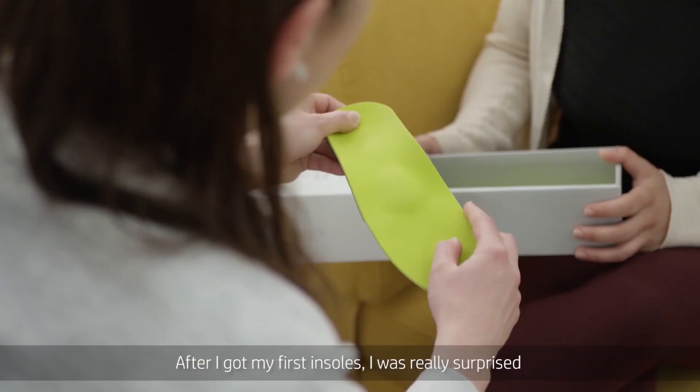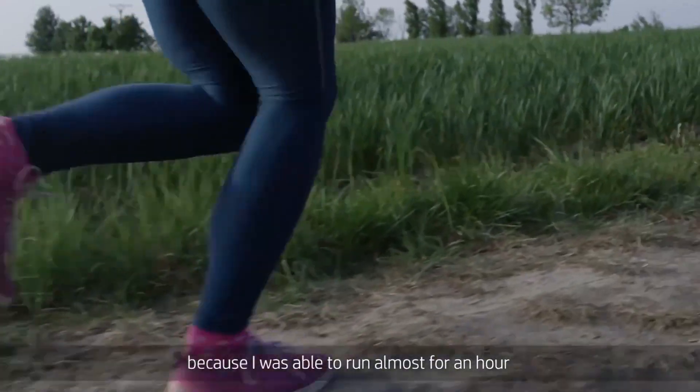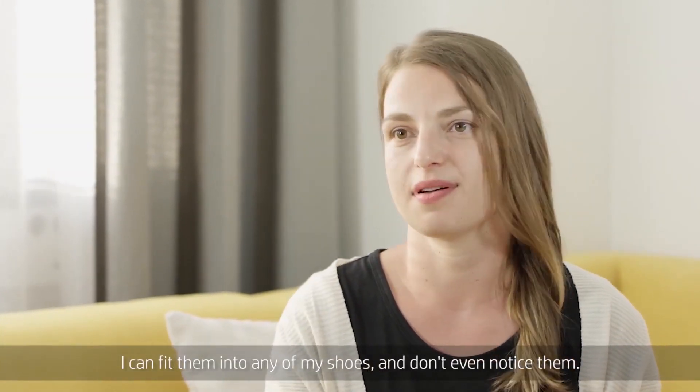After I got my first insoles, I was really surprised because I was able to run almost for an hour without noticing any pain. I can fit them into any of my shoes and don't even notice them.